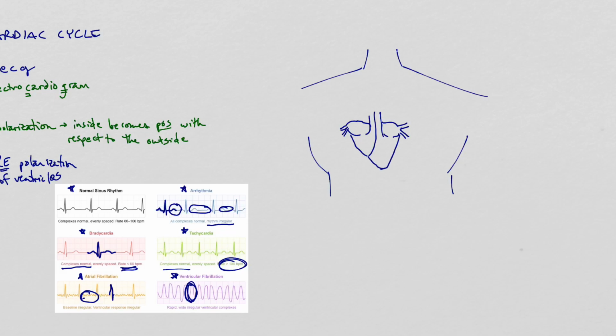There we go. Okay. So in an artificial pacemaker, you put the little device here. It's an electrical device that has batteries coming out of it. And you thread, this is really interesting, you thread it into the superior vena cava. I'm going to redraw how I have my superior vena cava here. All right, here's my inferior, here's my superior vena cava. I shouldn't close that off so much.